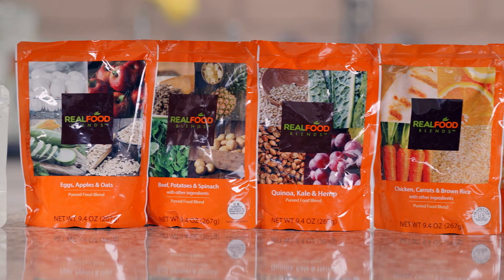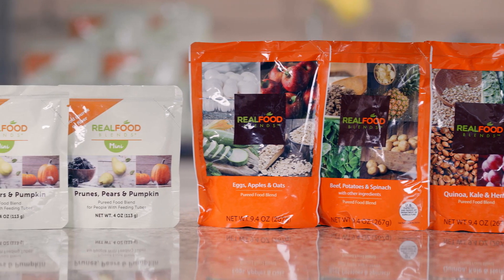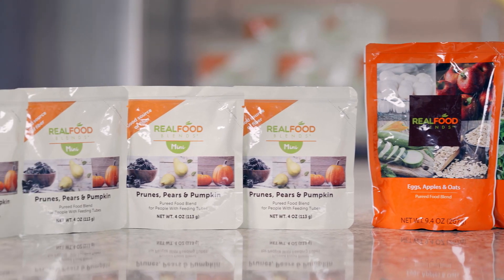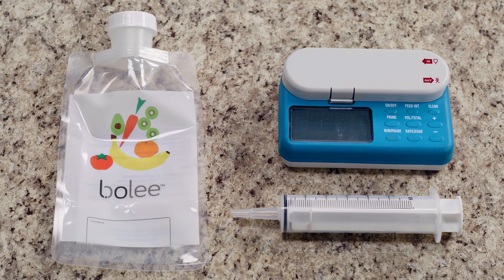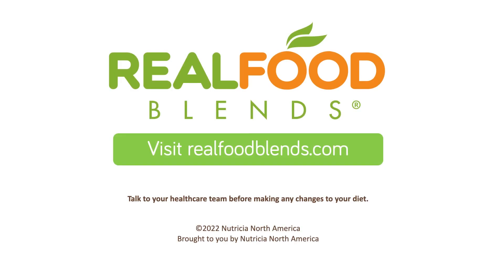I hope this video demonstrates how easy it is to administer real food blends using the bolus reusable nutrition bags. Remember that the bags can be used up to 15 times and the Bolink large cap is replaced every 24 hours. If you use a syringe or a pump, be sure to watch our additional videos. Thank you.